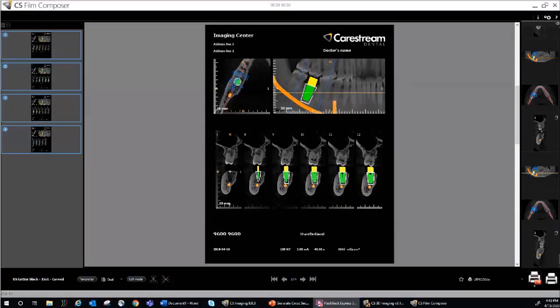In this lesson, we will look at generating cross-sectional reports for a CBCT scan using the CS3D Viewer software. This is a valuable tool in which a series of cross-sectional slices may be generated through a selected region of interest.